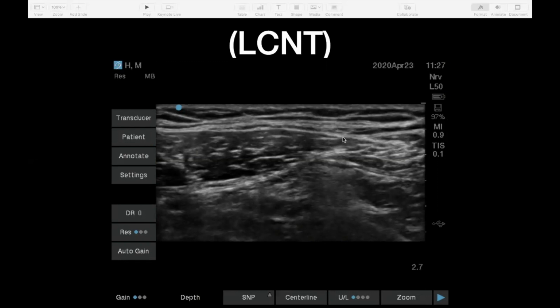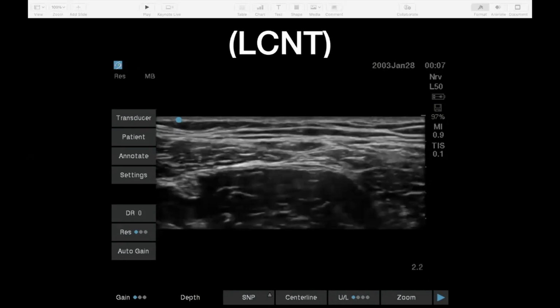So it's sartorius muscle here, the lateral border of sartorius, and there's quite a flat, fat-filled triangle. I think hopefully you can see there's something in there. Again, on a still image you couldn't be sure, but if you scan up and down a bit, you'd get an idea, hopefully, that there was something there. And then a bit further down the leg, it's divided again. This picture shows the fat-filled triangle quite nicely.